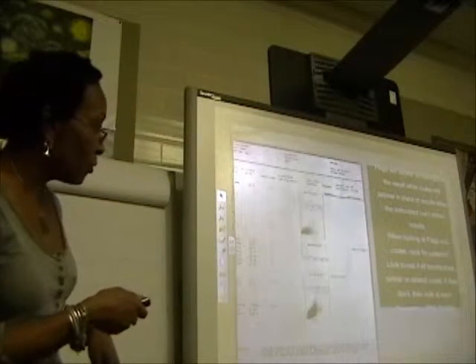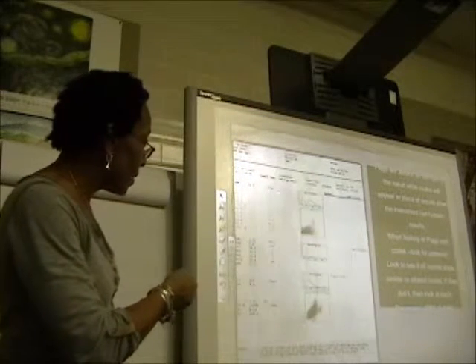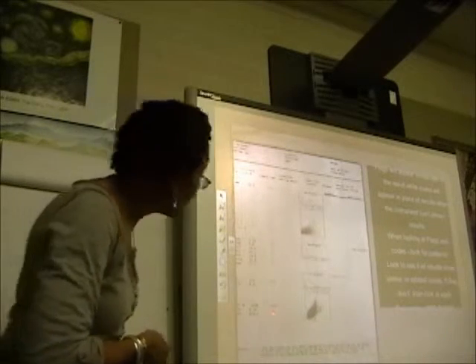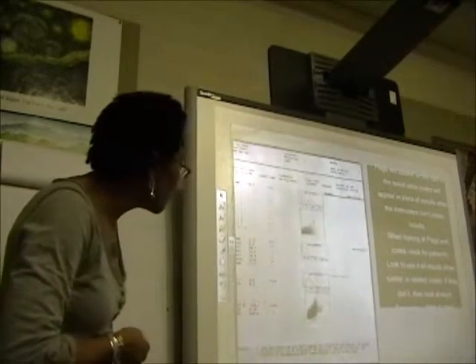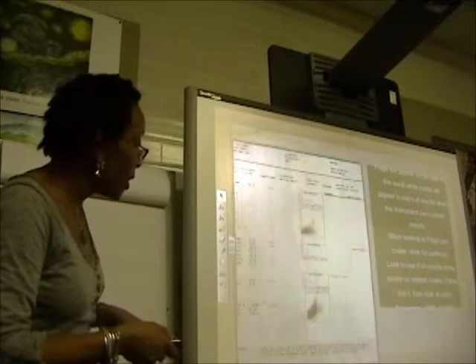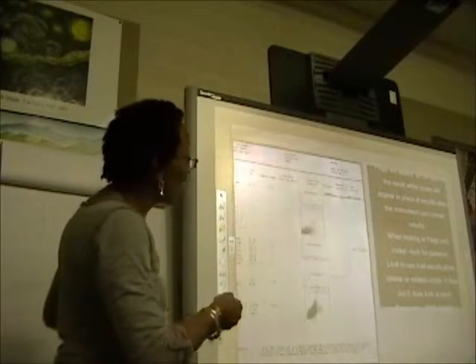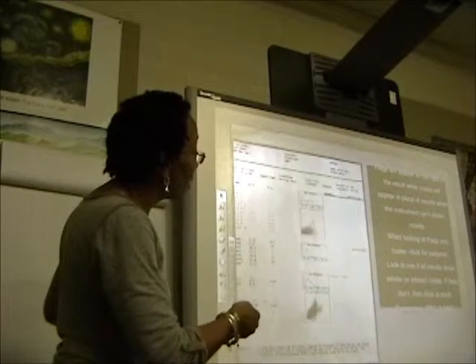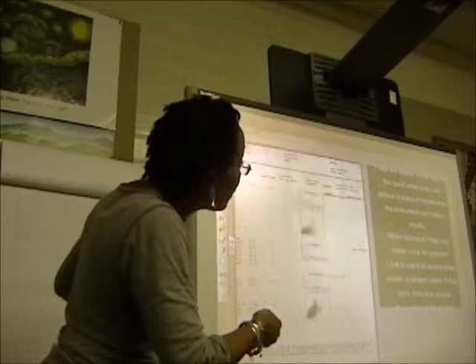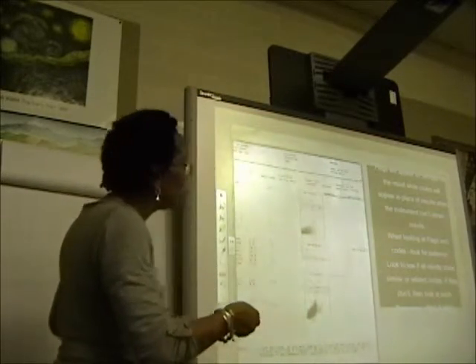Okay, this is an abnormal flag. And whenever you get a flag, it's going to appear to the right of the result, like down here. That's a high limit for the reticulocytes, okay? So it's beyond the normal parameters. So it's not critical, but it's high, okay? And so that's a definitive flag, and that'll tell you that you've got high reticulocytosis going on here.